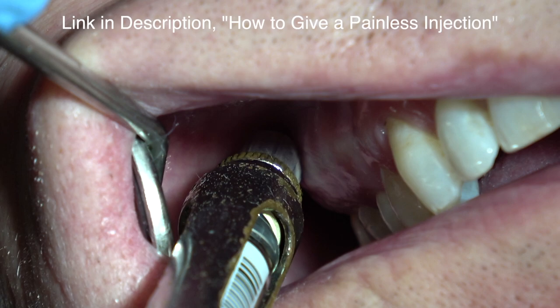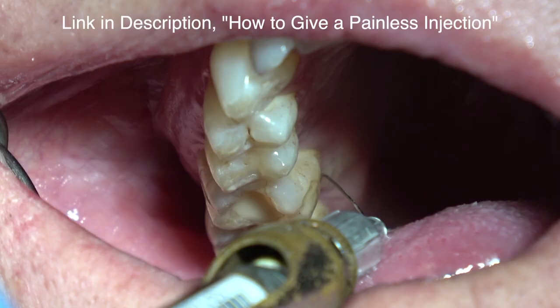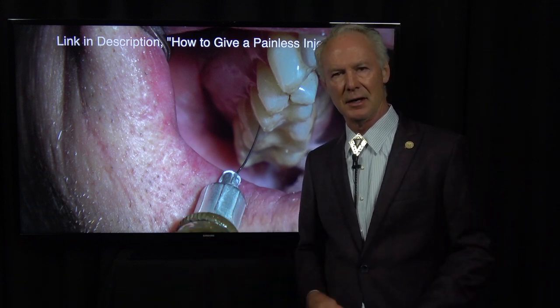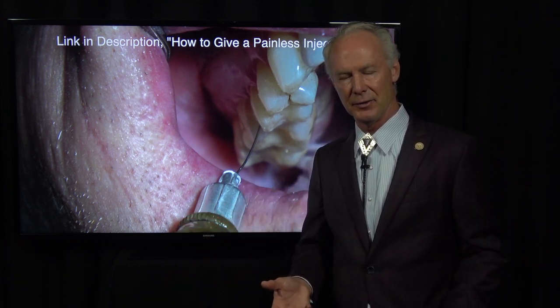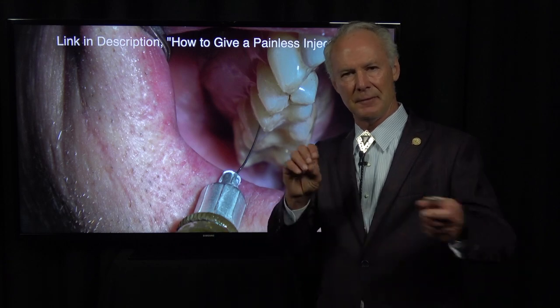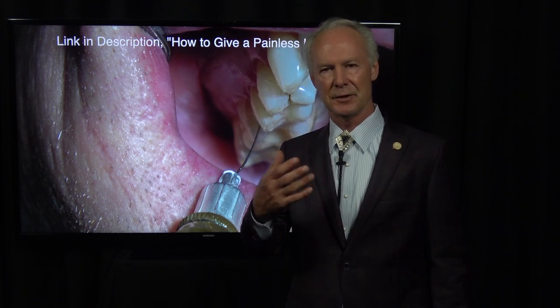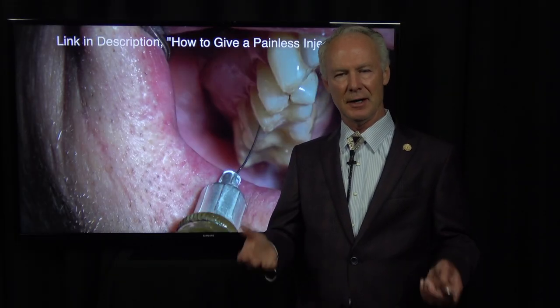Painless anesthetic is so important with these cases. Intraligamental is imperative if you're performing endodontics, unless it's a very elderly person. With those patients, the nerve is pretty sclerotic and it's probably not so important, but I always give it because I do not want my patients to feel anything, especially if you're extracting a tooth, performing endodontics, a crown on a tooth, something that's pretty significant, because patients are terrified of dentistry.